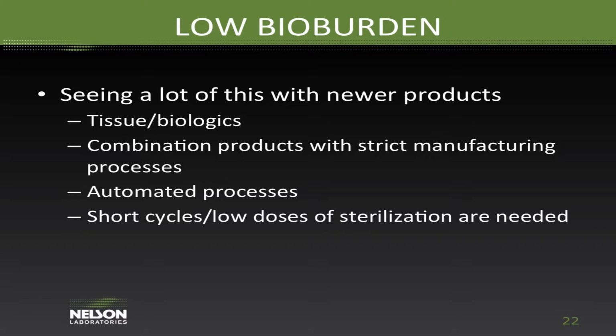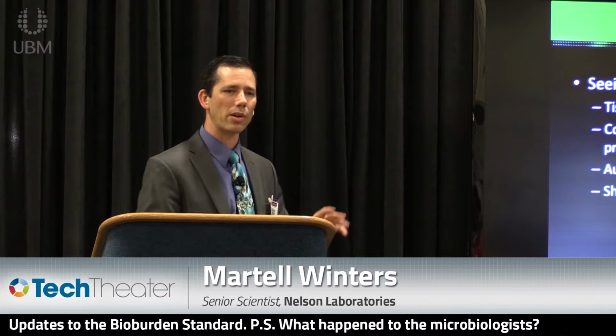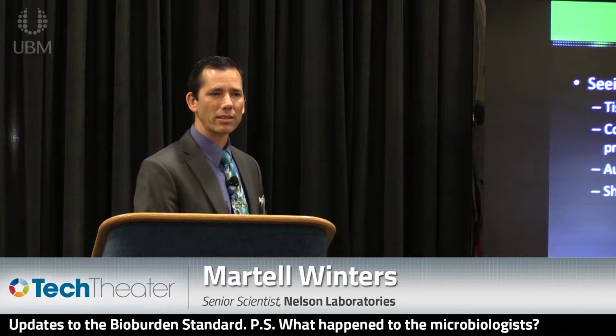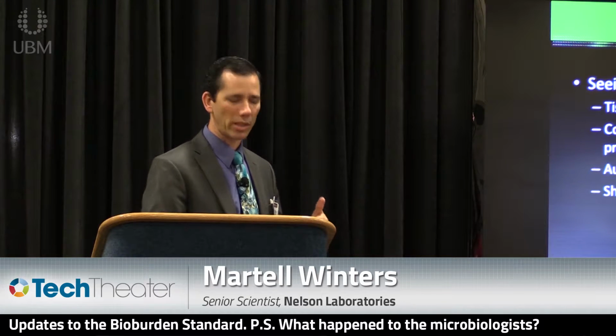Tissue and biologics tend to be fairly clean, usually. And then also, the bottom one there, a lot of newer products are more high-tech, and so you can't just blast it with a normal dose of radiation or a normal cycle of ethylene oxide. Oftentimes we're seeing more products coming in that require more optimized cycles, and as a natural consequence of that, the bioburden must be more strictly controlled.